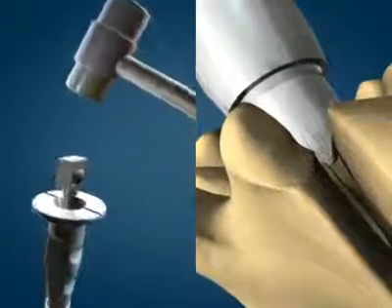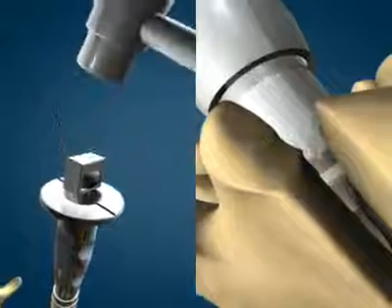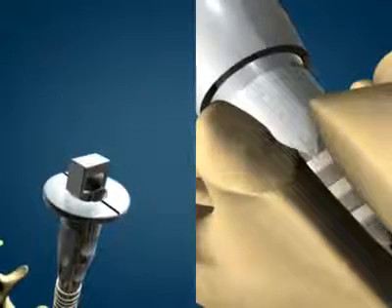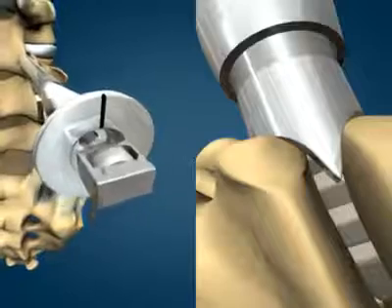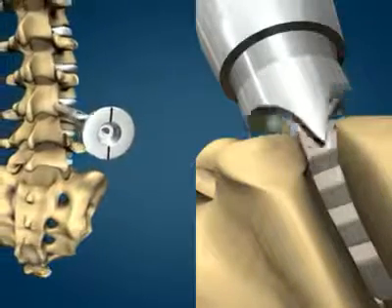Gently tap the inserter until the depth stop hits the proximal end of the guide. NuFix is now in place within the facet joint. Remove the inserter, drill guide and dilation tube three.